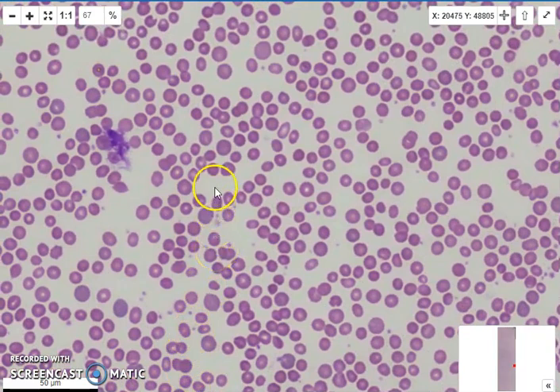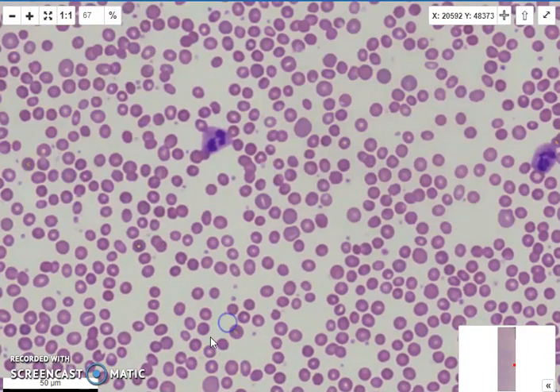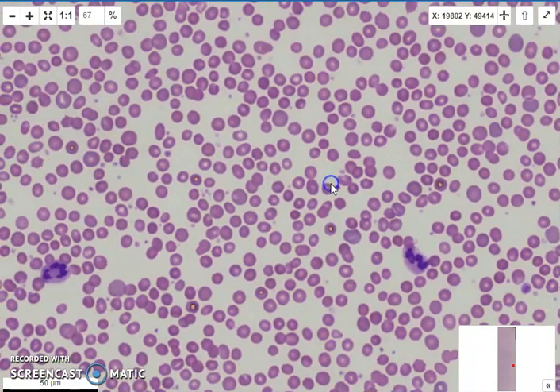So what makes a good spherocyte? A spherocyte should be perfectly round. It should be smaller than the other red blood cells. And it will lack central pallor. So that's what I'm looking for when I'm looking for spherocytes. And when I'm looking at this blood film, it is a little bit blurry. I don't know if that's the VPN or just the slide. But our spherocytes are perfectly round, lack central pallor, and smaller than our other red cells.